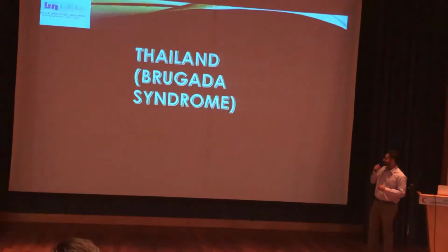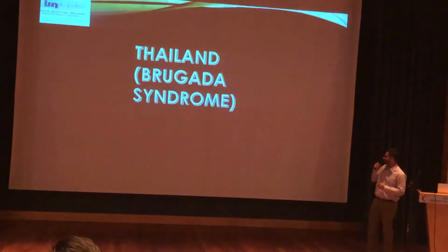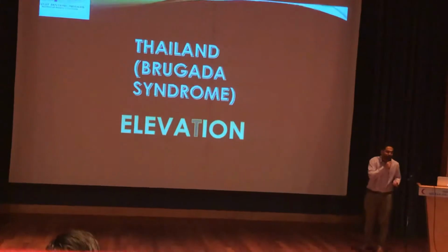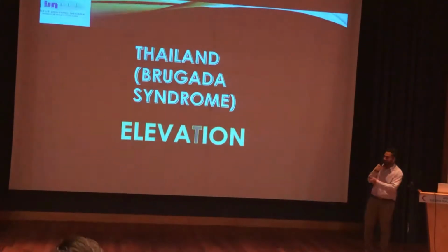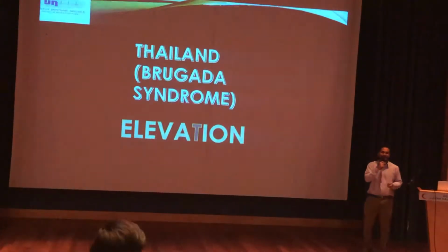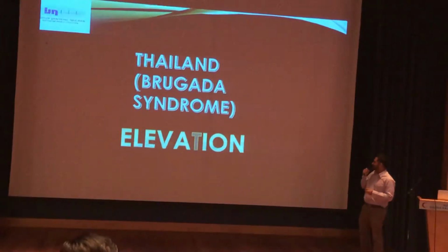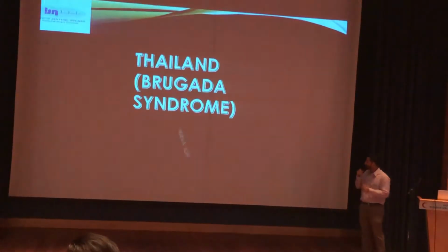So, Thailand, T, or Brugada syndrome. It doesn't make sense, but you know Brugada. I told the story, right? I told the story so I can put in the elevation. Don't arm me like that, come on.